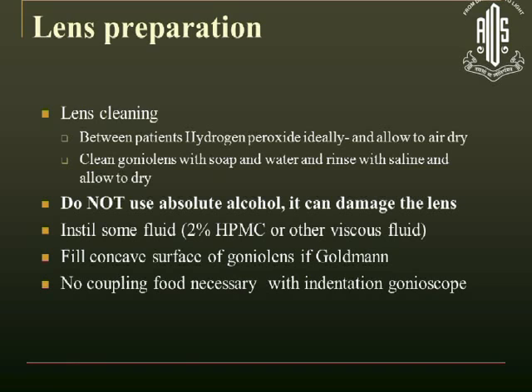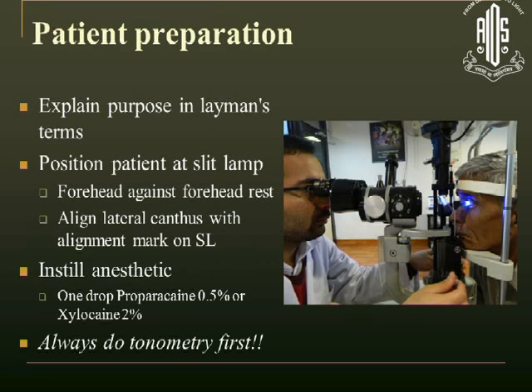Usually, the Goldmann requires instillation of some fluid; 2% HPMC does just fine. You need to fill the concave surface if it's a Goldmann, but the indentation ones don't really require it. The tear film is good enough and no coupling fluid is necessary. It's important to explain to the patient in layman's terms.